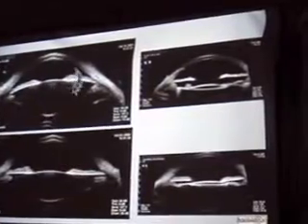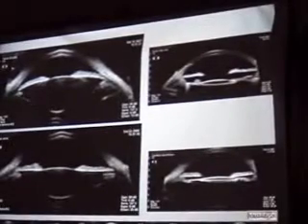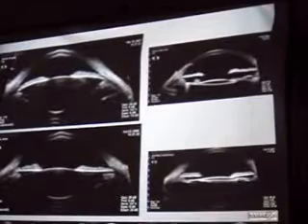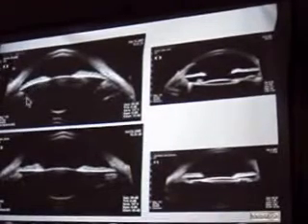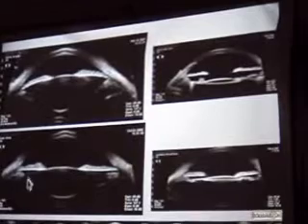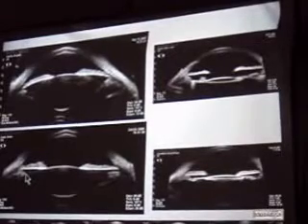If I remove this cataract, the distance between the equator, which is going to be the anchoring vector for the bag where the IOL is going to be implanted, is going to stay almost a millimeter away from the iris plane. Here is the equator, here is the iris plane. If I look down here, here is the equator, clearly closer to the iris in this bottom picture than the one on top.